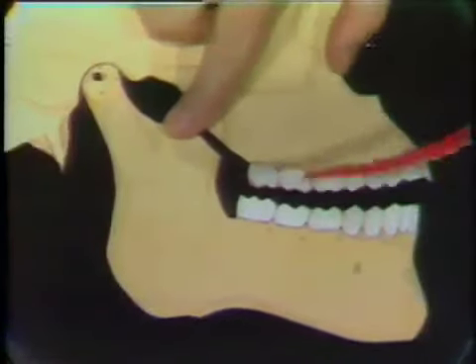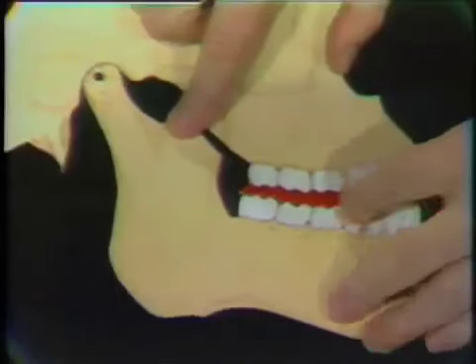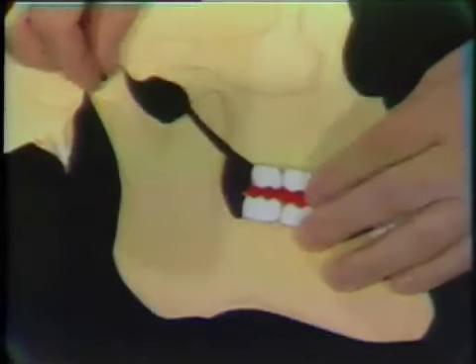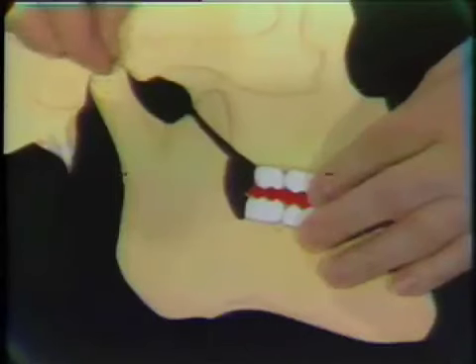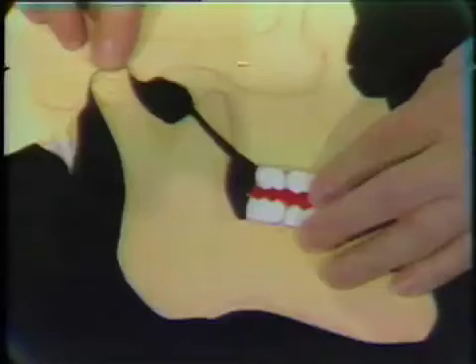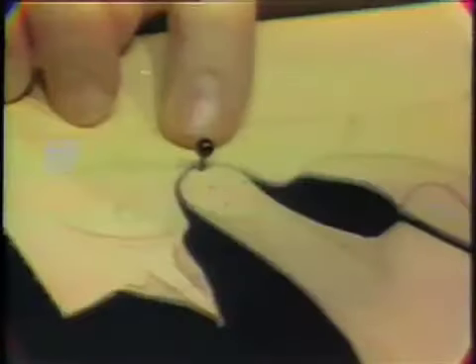However, let's suppose now that we've mounted the cast on the articulator with the centric relation registration, and instead of having the correct hinge axis, we have erred, and we have a hinge axis that is higher or above the true hinge axis, as we have here, and this is what we had on the patient.